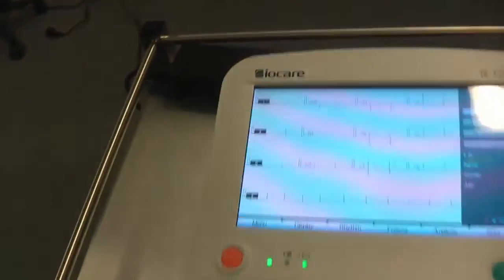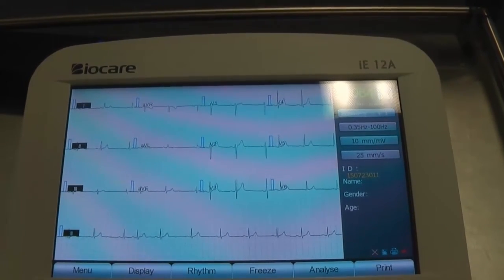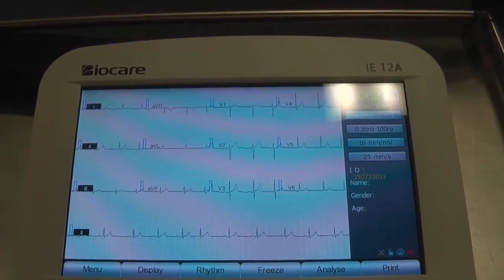Just have a look at the trace — that's beautiful. Yeah, that makes such a difference.